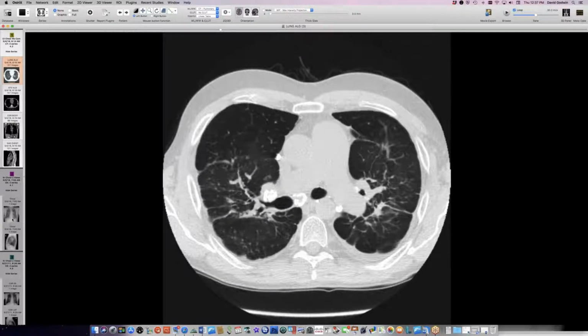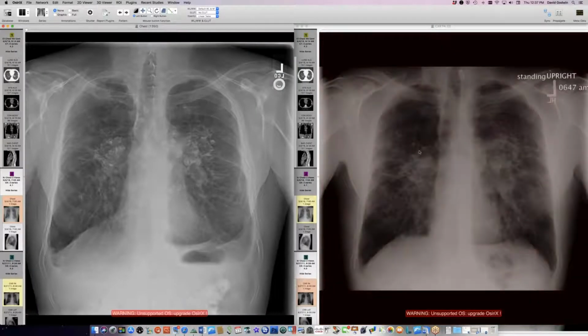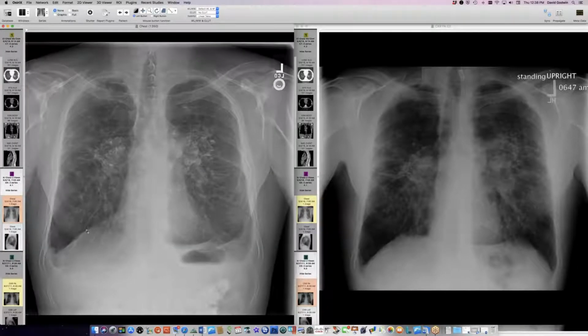So I like the progression here from the softer lung abnormalities crowding the hila to this scarring pattern here and elevation of the vessels off the hila, progressive scarring, and tethering here of the lung bases, attempts to make juxtaphrenic peaks and so forth. And the pleural involvement, I'm attributing this to the same process. You don't see that much pleural involvement in sarcoid, but this one I think has a pleural thickening that's legitimately probably part of the same process, probably part of sarcoid. Yeah, very impressive.